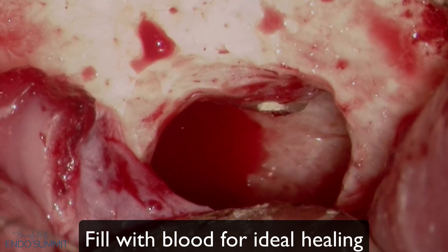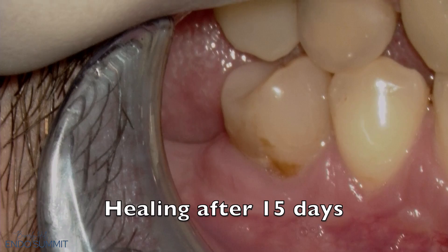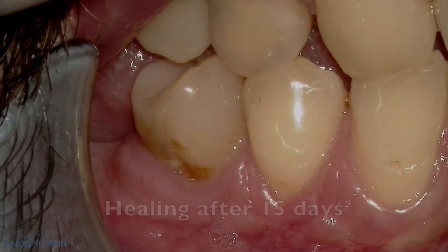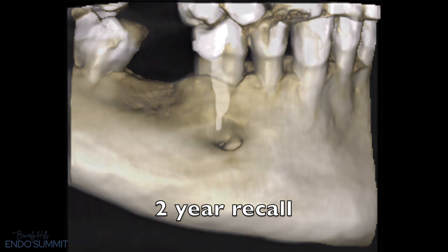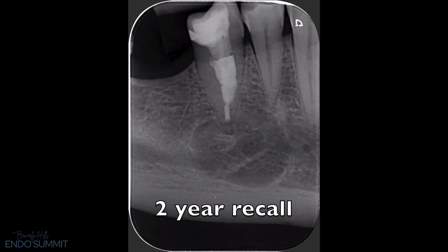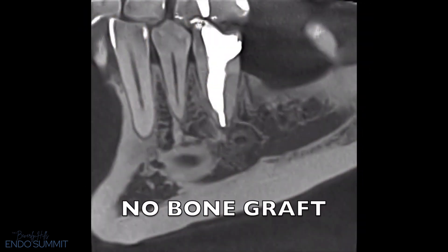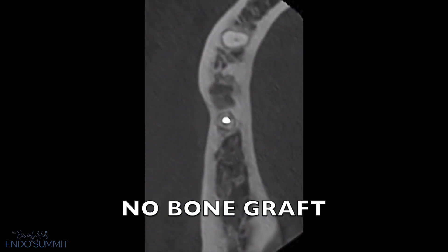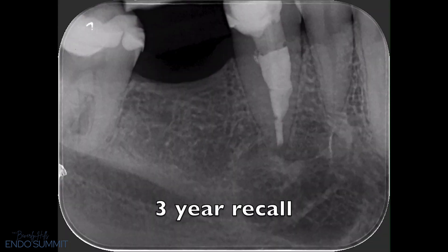This is a very important point that he'll be teaching at the upcoming EndoSummit on Endodontic Surgery Mastery. You can see the healing after 15 days — soft tissue healing is perfect with no recession or any other periodontal problems. There's a post-op x-ray, a two-year CT scan recall with the 3D rendering showing the fill, and the bone fill is also seen on the CBCT. A radiograph after two years shows a beautiful bone fill, and then a three-year CBCT recall image shows complete fill as well — complete fill with no bone graft. This is pure healing after a meticulous and precise endodontic surgery procedure. You can see in the bucco-lingual section the fill as well, and at three years, a full bony regeneration.